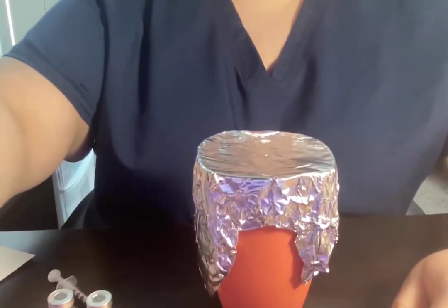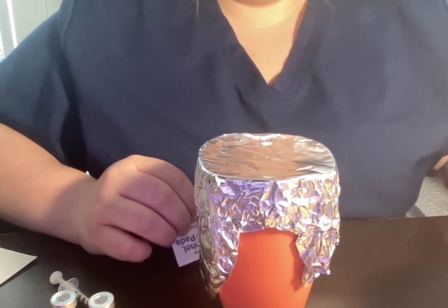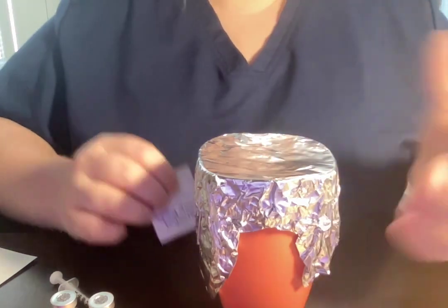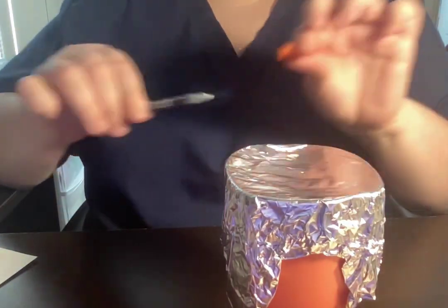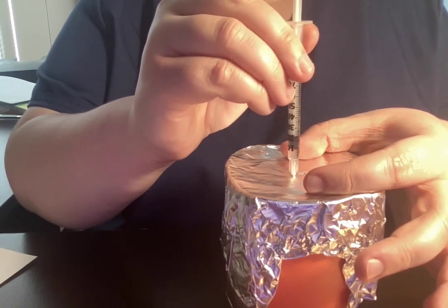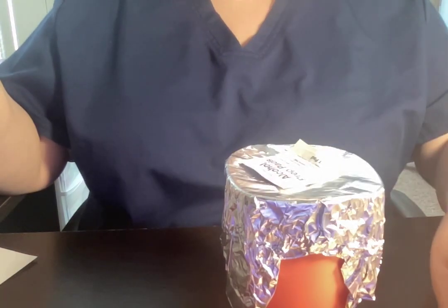If I can pinch 1 inch I go to a 45-degree angle; if I can pinch 2 inches I go at a 90-degree angle, so I'm going to say that I can pinch 2 inches. I'm going to clean the area with the alcohol prep and check one more time to make sure I have the correct dose and the correct patient. After I've cleaned the area, I'm going to pinch the skin, go in at a 90-degree angle, inject the medicine, come out, and apply pressure.